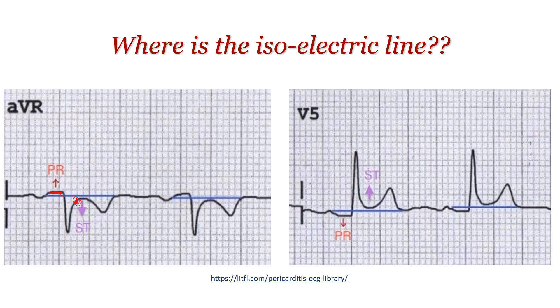If you say this is an ST depression, I would argue: why not call it a PR elevation? The only area on the ECG with no electrical activity at all is the area between two complexes — after the T wave and before the next P wave. So your baseline should be the TP segment. That area here is your baseline.